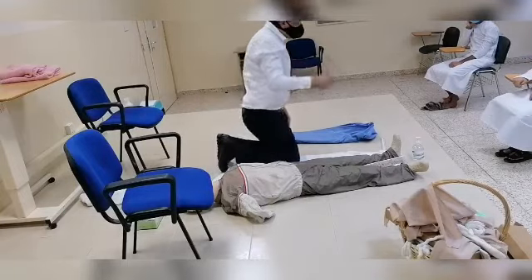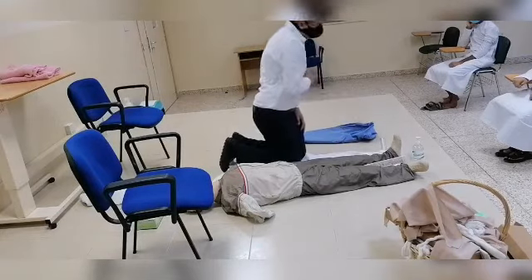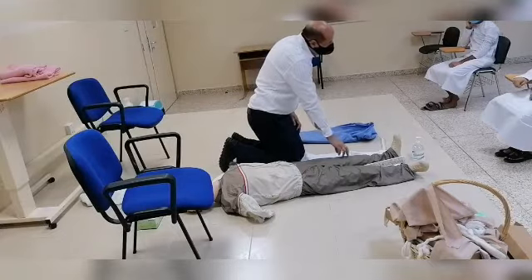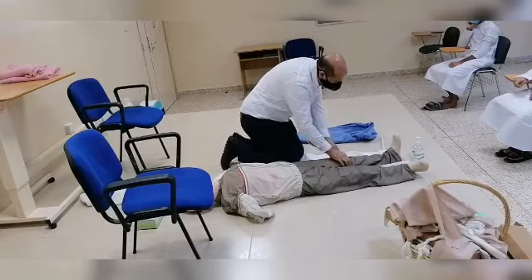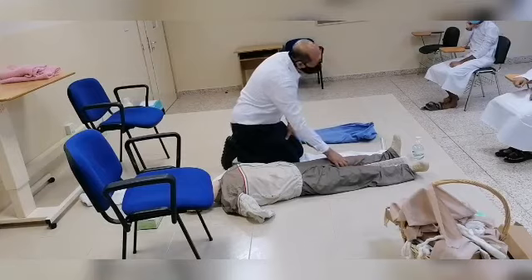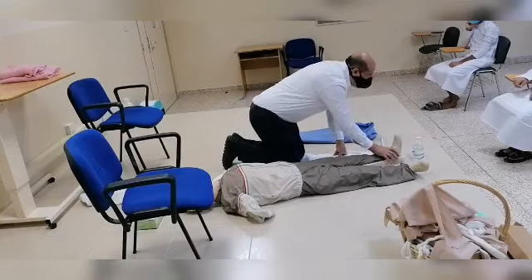As we said before, we have to fix the joint above and the joint below the fracture. So here the knee joint should be fixed. The piece of wooden splint has to extend above the knee joint, and we also have to fix that.